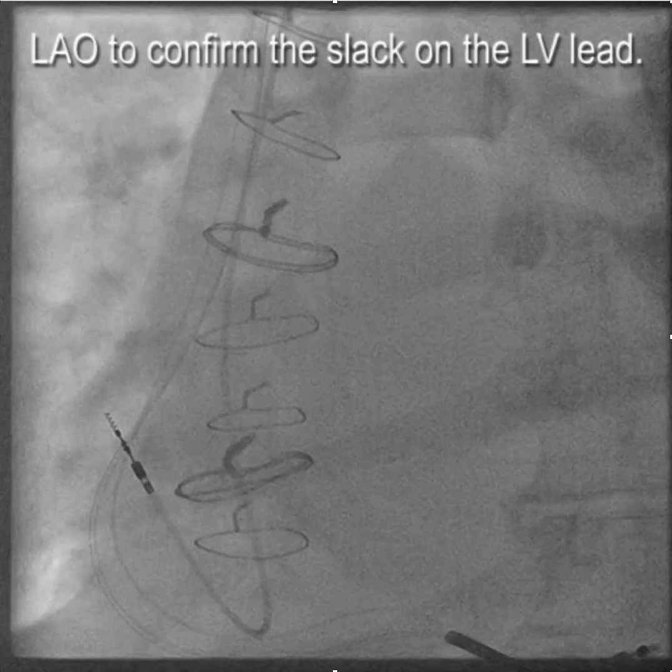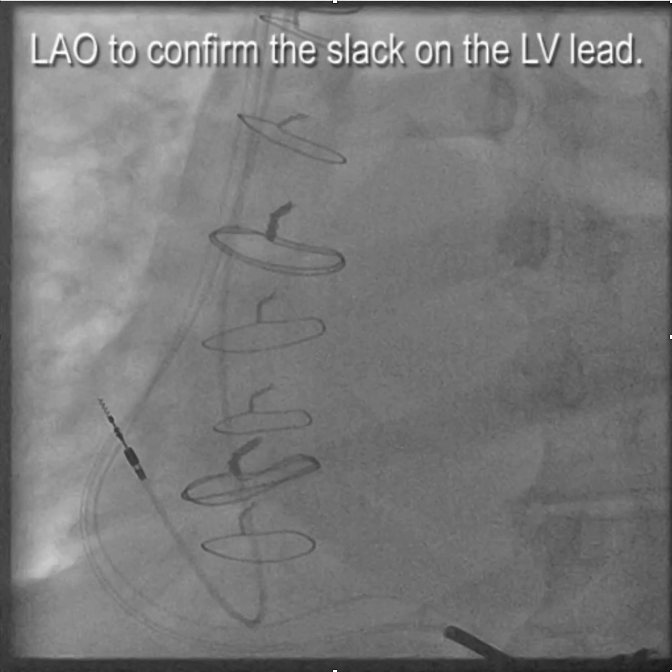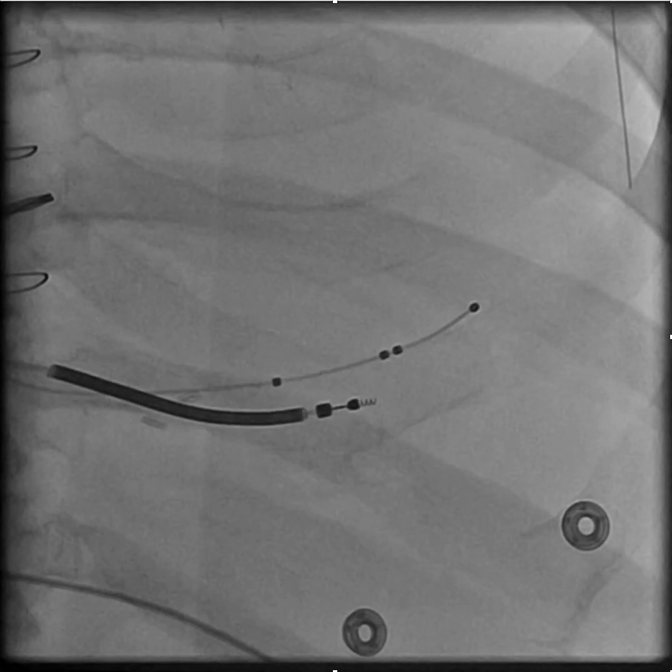We put the lead in, take the wire out, take the stylet out, and make sure we have adequate slack by checking the position in the LAO. You want the pacing lead to come out, go across the bottom of the right atrium, and then up along the lateral wall. And now we have a successful implant.